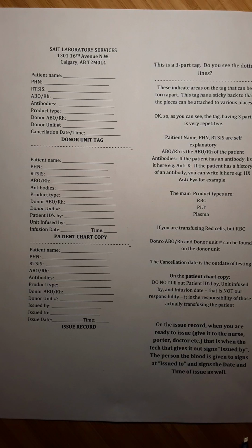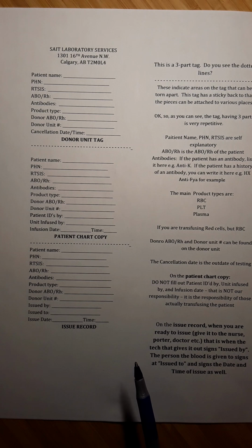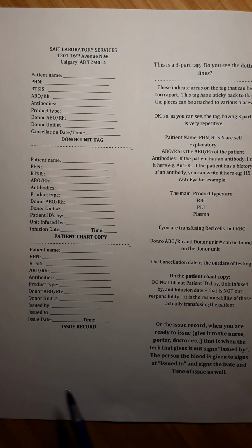Hi there. I just wanted to spend a couple of minutes going through this transfusion tag with you. I have uploaded this document onto the Brightspace course under Content and the module Pre-Transfusion and Compatibility Testing. And the document is called Transfusion Tag.